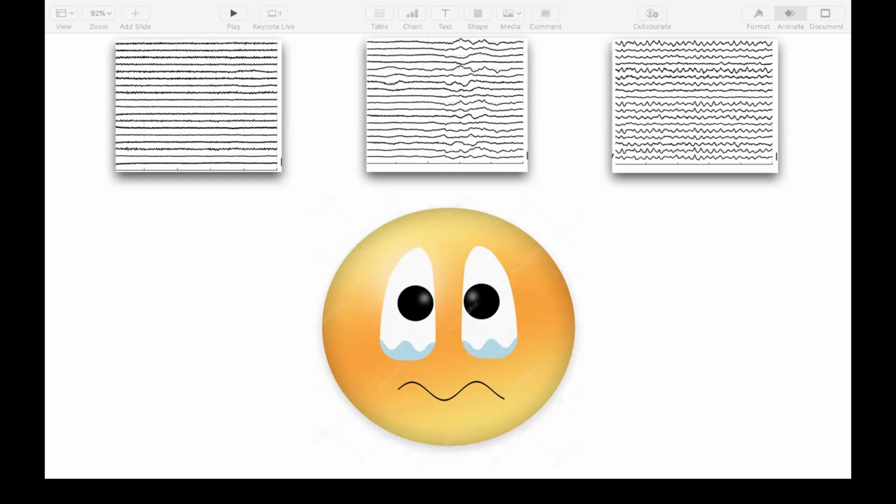But we also decided that maybe another approach, in particular deep learning, might work for these patterns. And well, there's a big boost in these techniques, as you know, and we were interested whether we could train a deep net with these patterns and see how well it performed as compared to a human observer, a human interpreter. And also to ease a little bit maybe the burden of the visual analysis that is felt. And of course, we cannot be present 24/7.